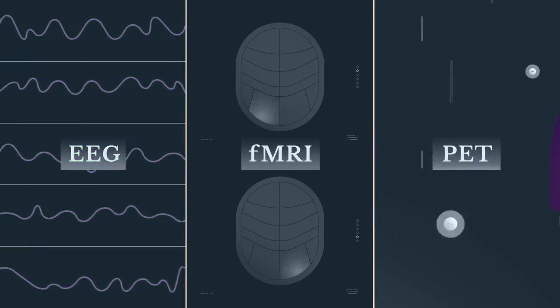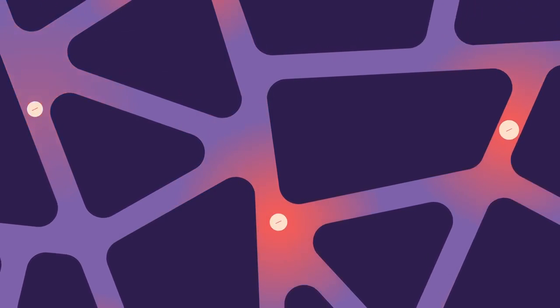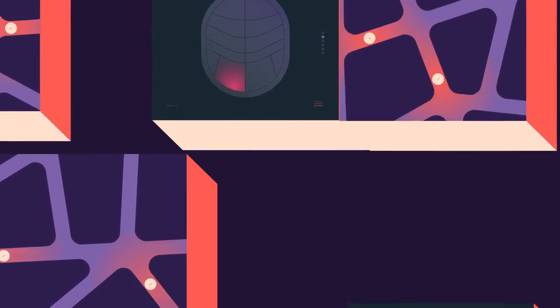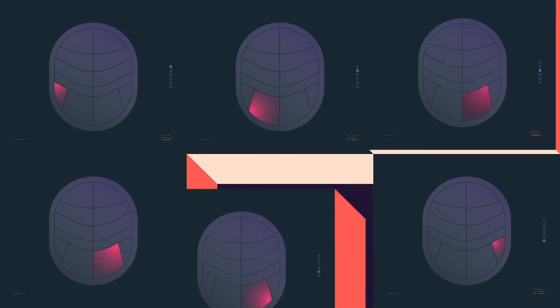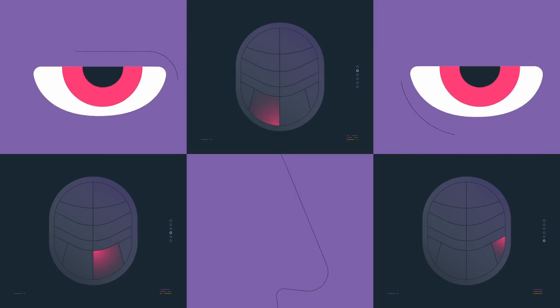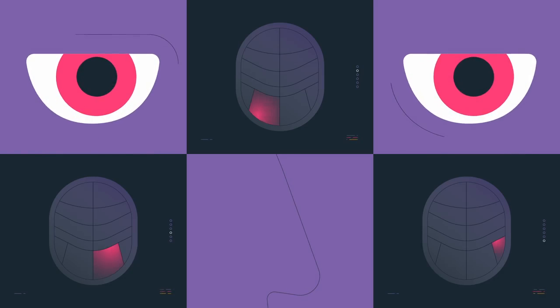To do that, you'd need another technique, such as functional magnetic resonance imaging, or fMRI. fMRI measures how quickly oxygen is consumed by brain cells. Active areas of the brain use oxygen more quickly. So watching an fMRI scan while a person completes cognitive or behavioral tasks can provide information about which regions of the brain might be involved. That allows us to study everything from how we see faces to how we understand what we're feeling. fMRI can pinpoint differences in brain activity to within a few millimeters, but it's thousands of times slower than EEG. Using the two techniques together can help show when and where neural activity is occurring.